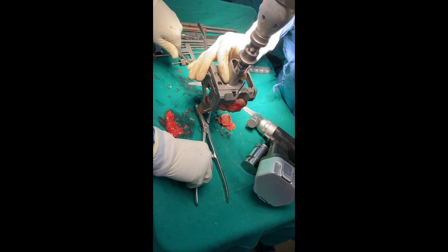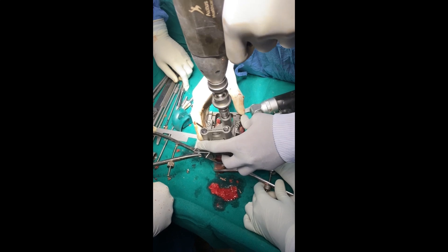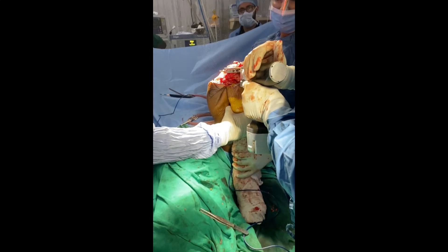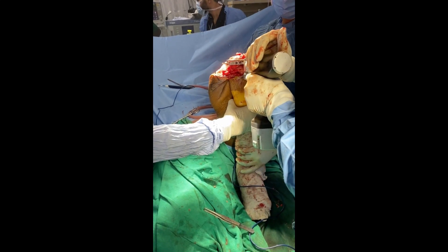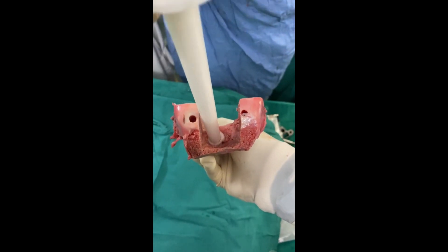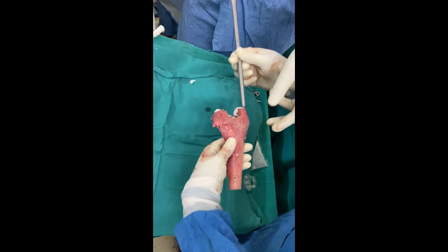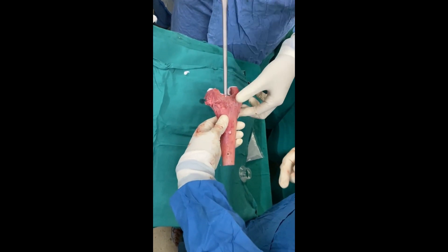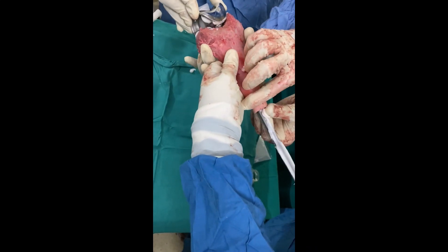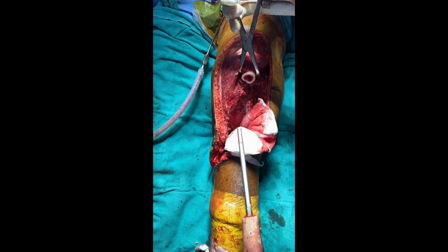Step 4: Prosthesis Installation. The autograft prosthetic composite is expertly positioned and fitted onto the prepared area of the femur shaft. Step 5: Joint Integration. Special attention is given to integrating the joint component of the autograft prosthetic composite, connecting the prosthetic joint to the surrounding bone and tissues to allow for natural movement and function post-surgery. The surgical team works with precision to secure the prosthesis, ensuring stability and functionality.